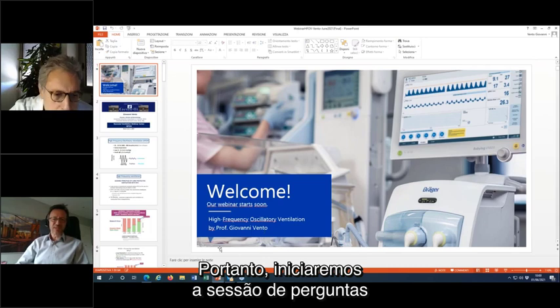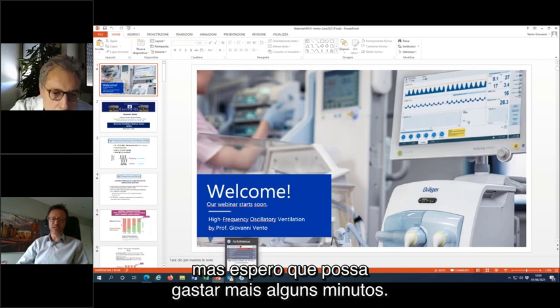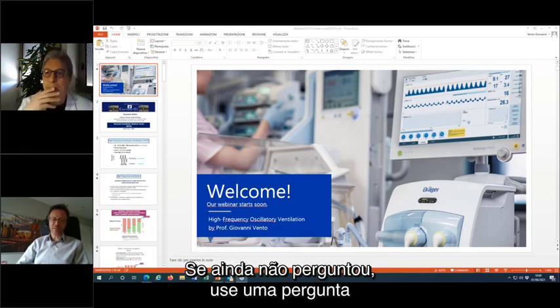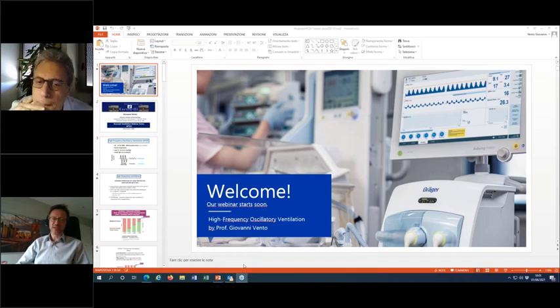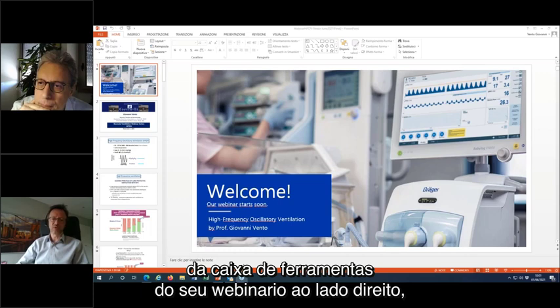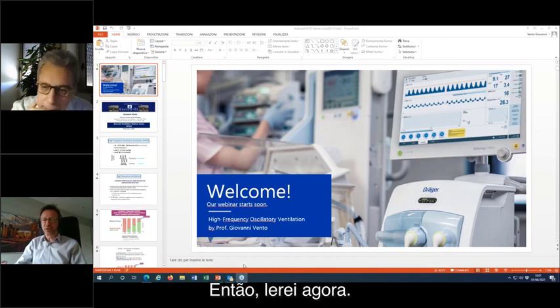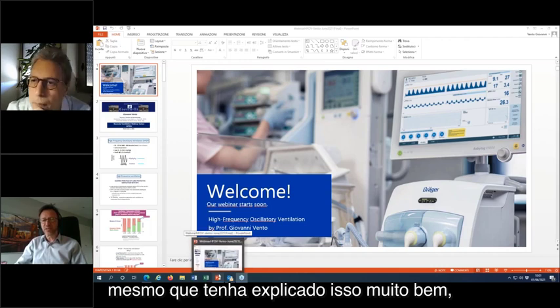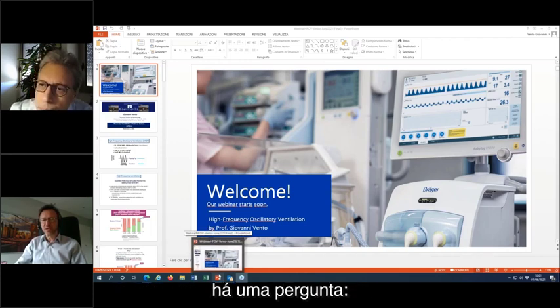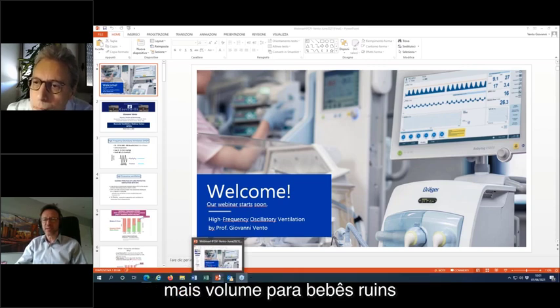So we will now start the question and answer session, a little late, but I hope that you can spend some more minutes. If you haven't asked already, use the question via the chat function or the question function of your webinar toolbox on the right-hand side. And we, in fact, already have a few questions, so I will read them now for you. Even if you explained this quite well, there's one question: what is your lung recruitment strategy with high frequency plus volume guarantee for babies with an FiO2 requirement of 100%?